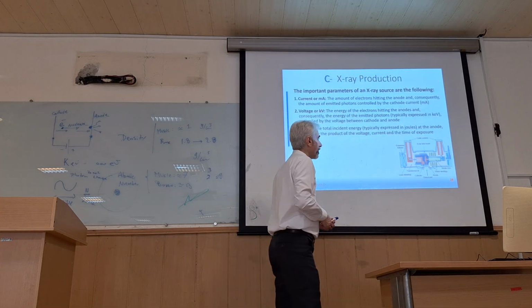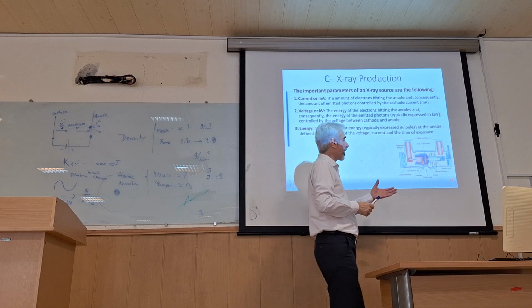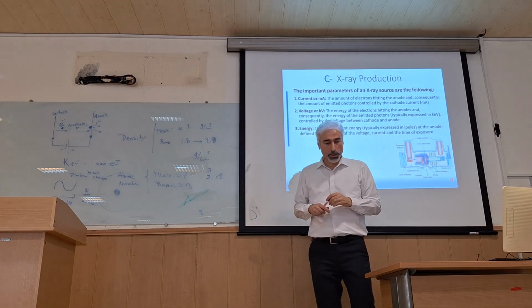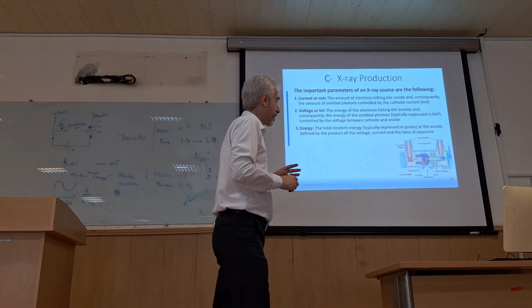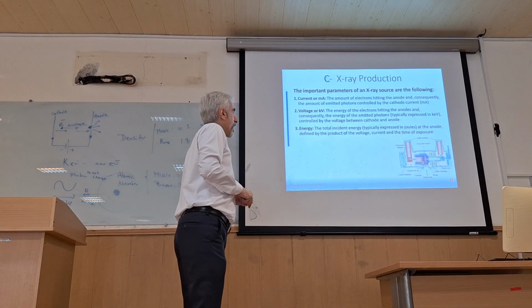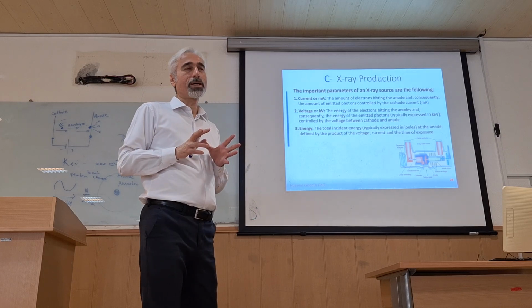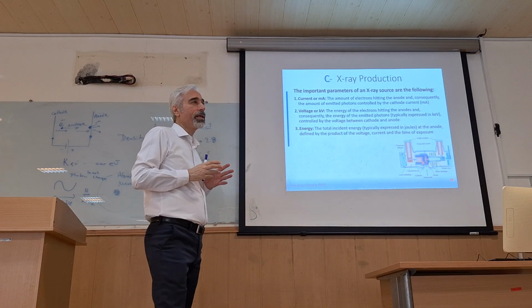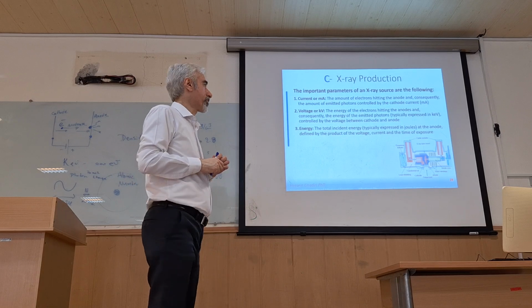So, you know, the structure of the X-ray source is very complicated. We don't want to go deep inside it, but what is important for this class is there are some parameters that should be adjusted in the X-ray source.